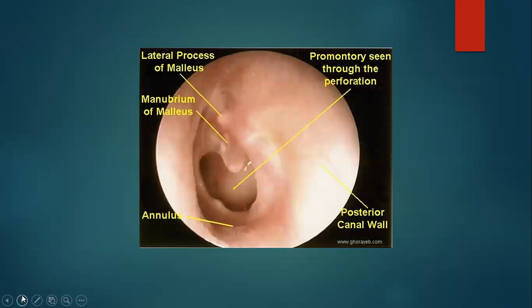Now what you see here is a perforation. So now it is perforated, and we have safe perforations and we have unsafe perforations. But we are concerned about perforation. By the way, every perforation is not a referral criteria, because perforations do heal on their own.